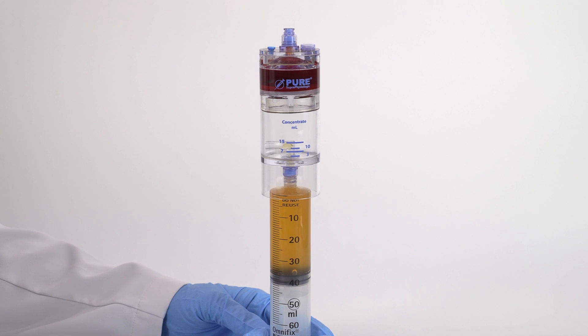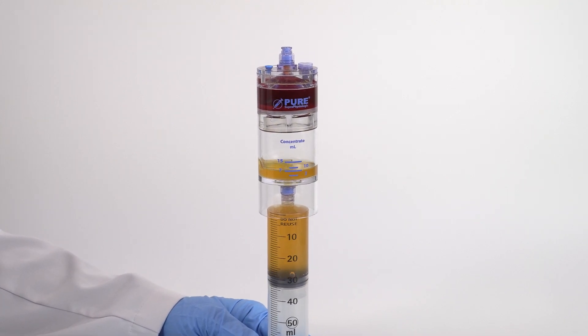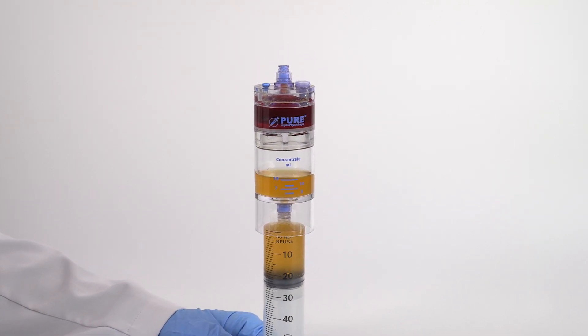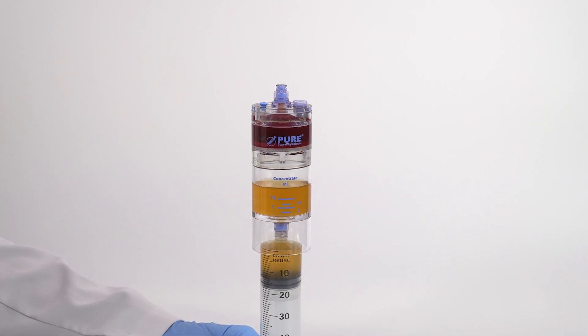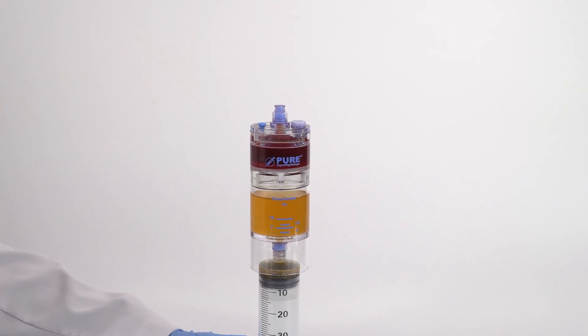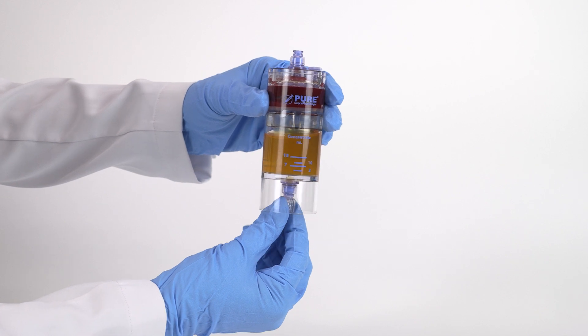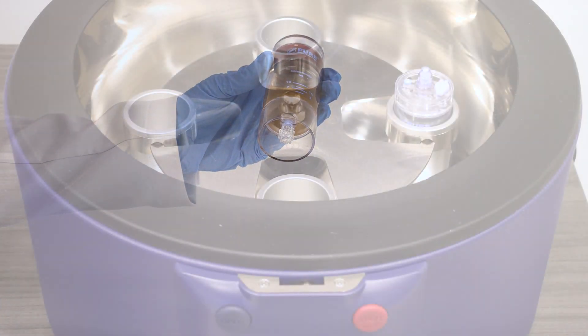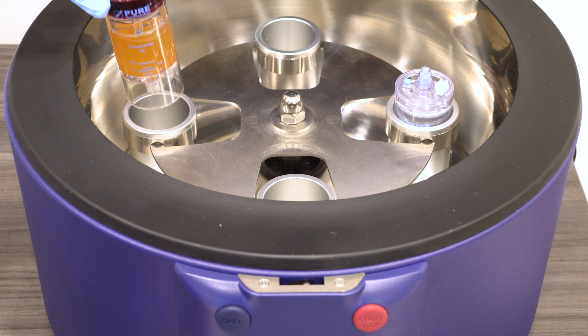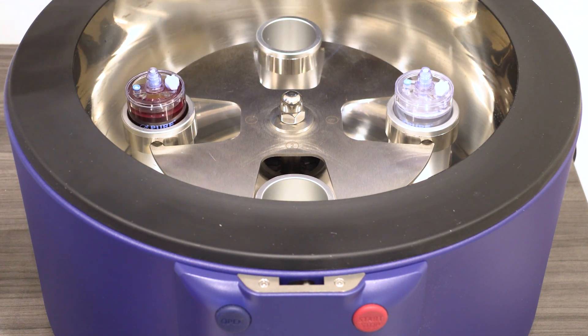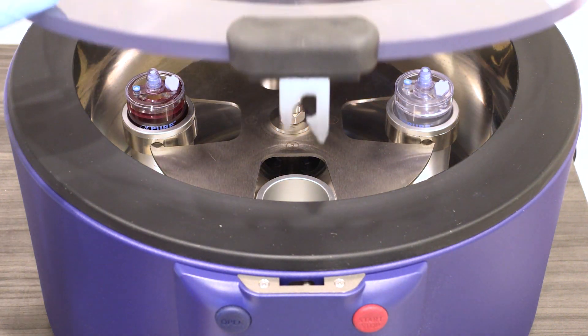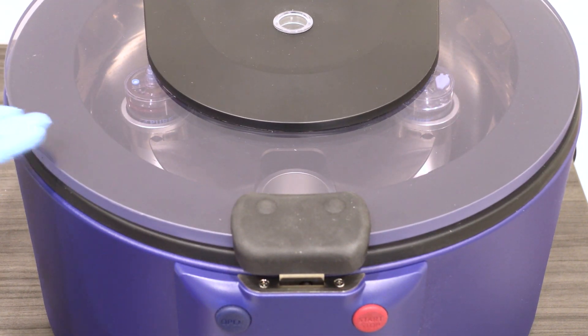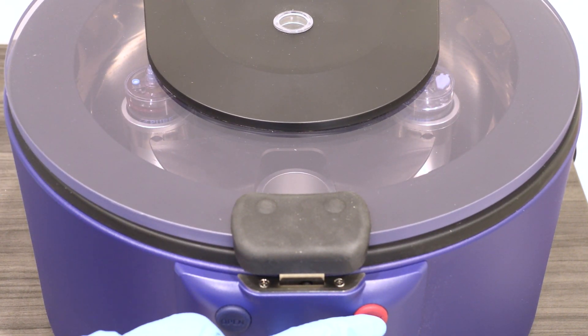Remove the clear non-vented cap from the bottom port of the device and inject the platelet plasma suspension through it. Place a sterile clear non-vented cap back onto the bottom port. Place the device back into the centrifuge rotor and follow the protocol settings provided in the IFU. Close the centrifuge lid and press start.